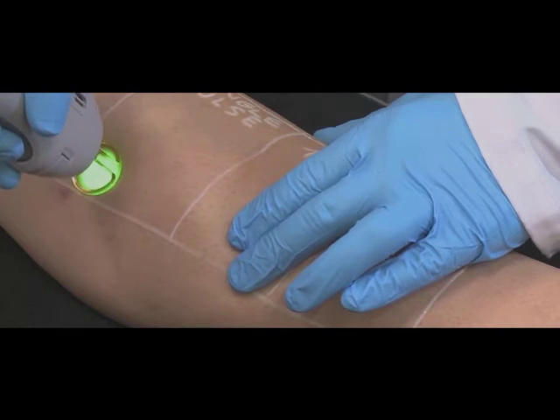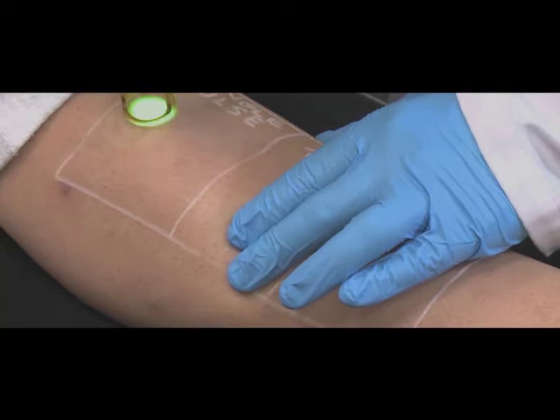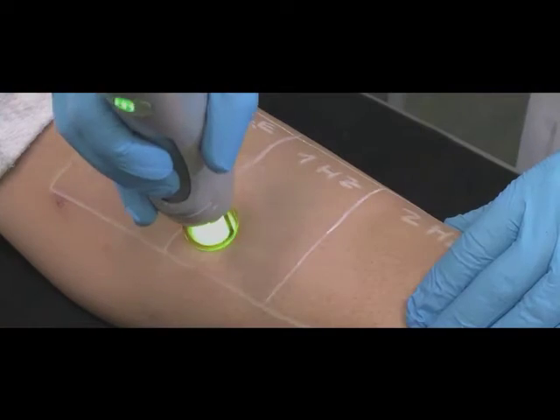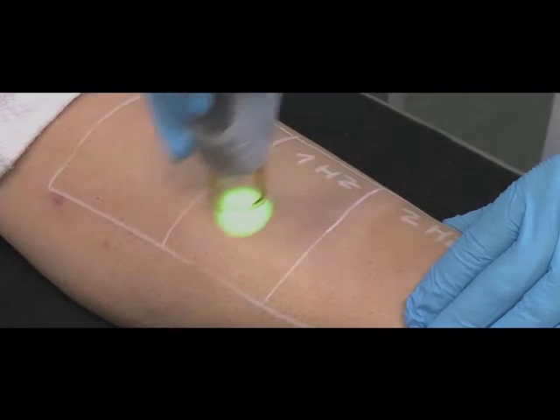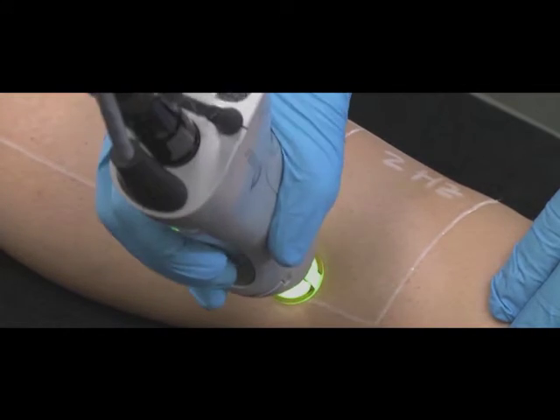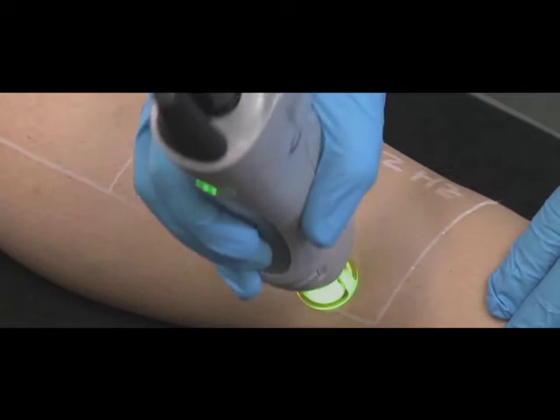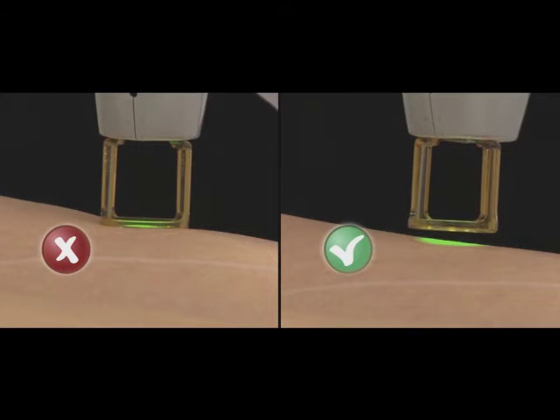Once you begin, remember the distance gauge should be placed flush, perpendicular, and overlapping. The GentleMax Pro is capable of very rapid treatments from just a single pulse all the way up to 2 Hz. Be certain that as you move the distance gauge across the area, that it is flush against the skin and neither pushing nor hovering in the air.